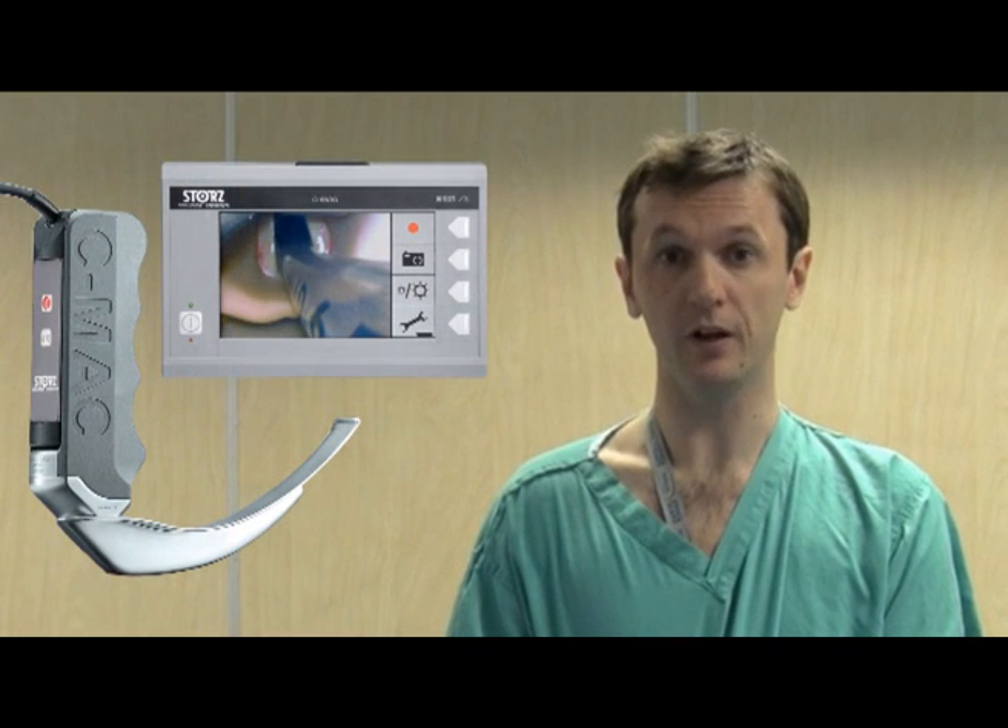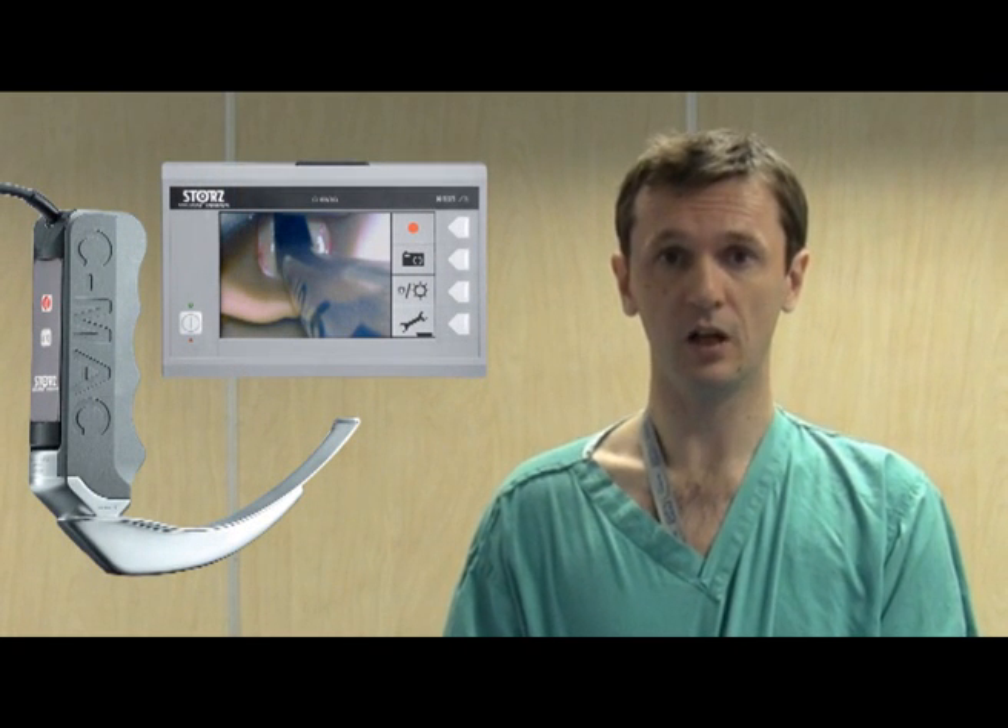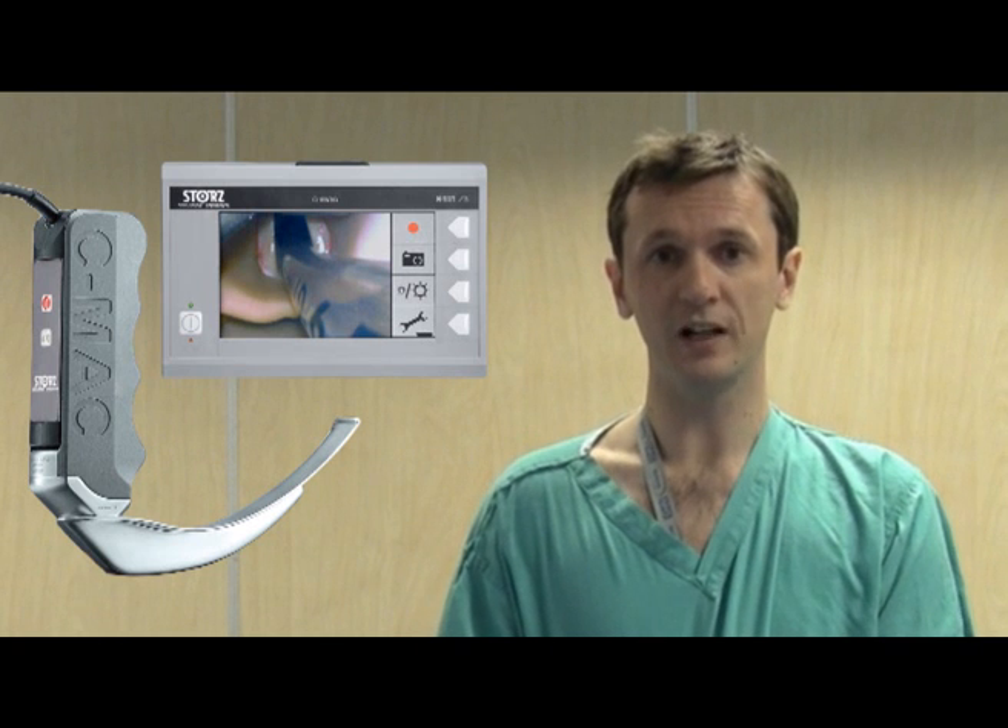Now we'll move on to the C-Mac laryngoscope. The C-Mac looks very similar to the Macintosh but there are some key differences. First I'll perform a silent run-through of how to use the C-Mac for laryngoscopy and intubation, and then we'll take you through it again bit by bit.